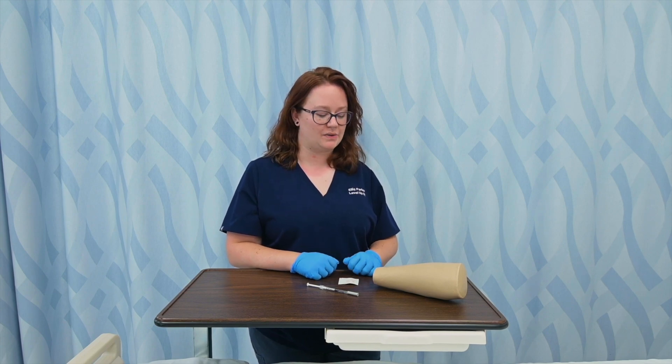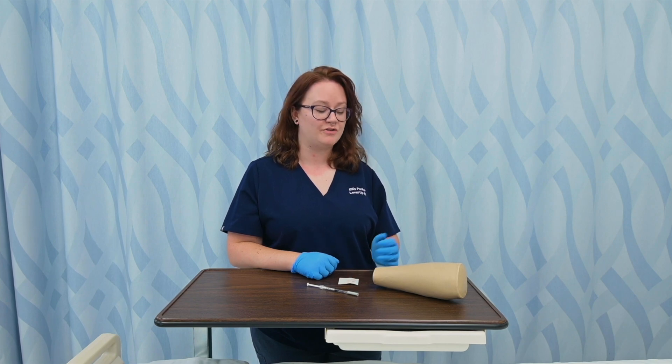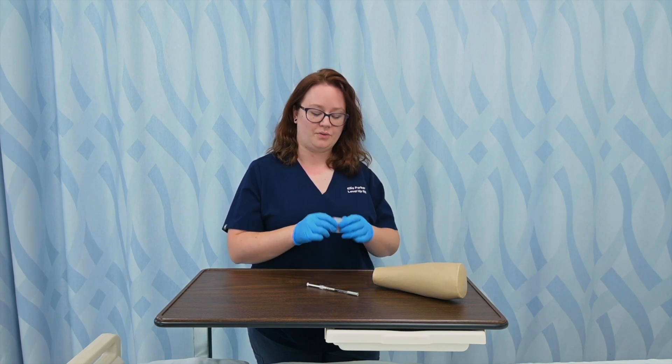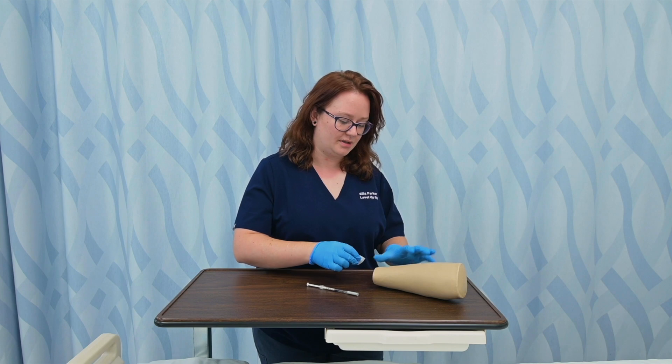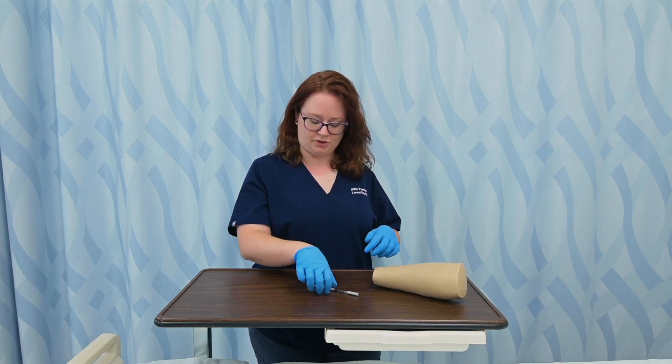Intradermal injections are almost always done on the forearm, so that's what we'll be practicing with today. After you select your site, you're going to clean it with an antiseptic swab, starting in the center and moving out. As that's drying, I'm going to go ahead and grab my syringe.